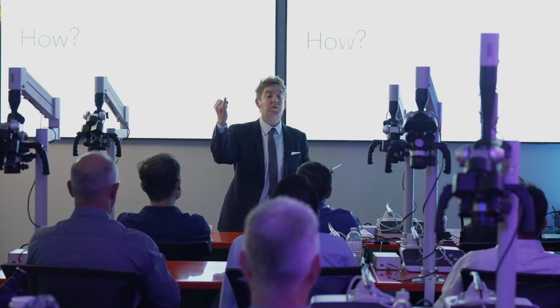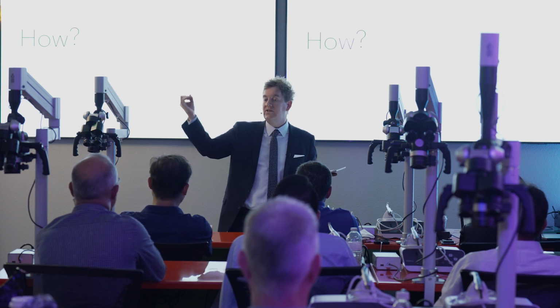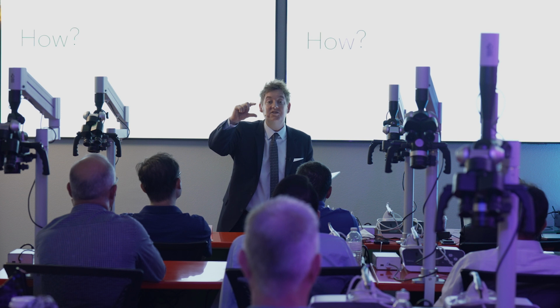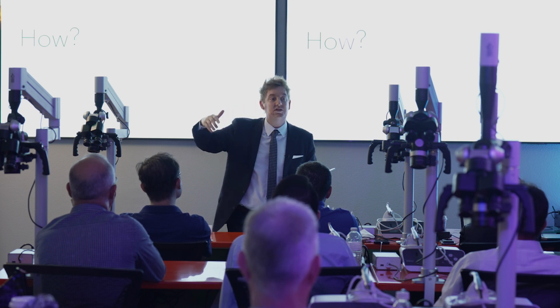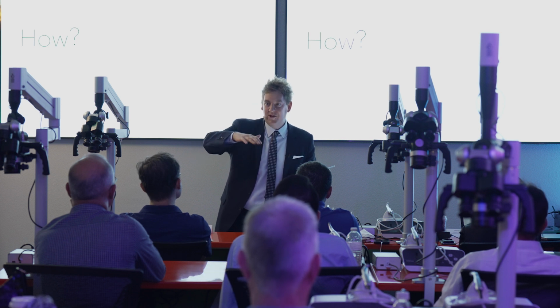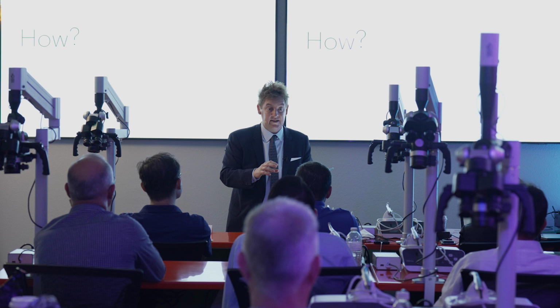You're going to compromise the ability to clean the prosthetic, which is going to lead to other issues. Or you're going to sacrifice material thickness, which leads to fracture of the prosthetic. One of those. You're going to have some restorative price to pay if you didn't properly treatment plan the case.